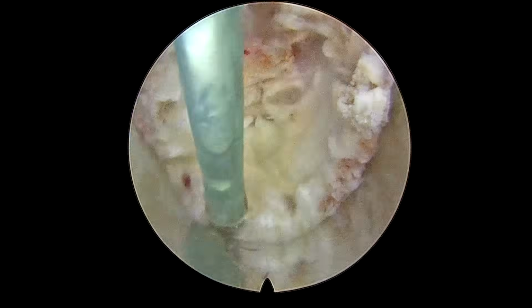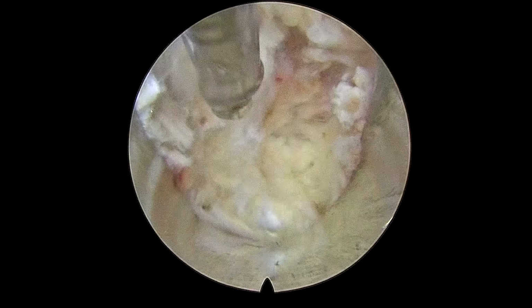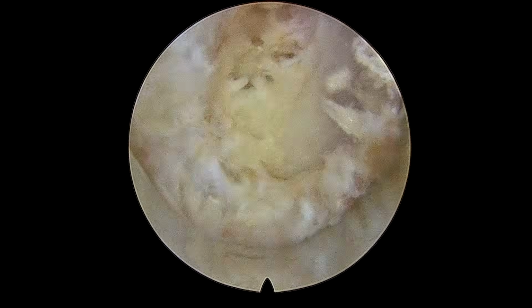Now if you see carefully, at 9 o'clock you can see there is a superior lamina, at 3 o'clock there is an inferior lamina. Right now I am coagulating vessels in the interlaminar window.